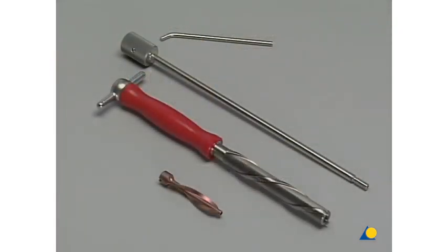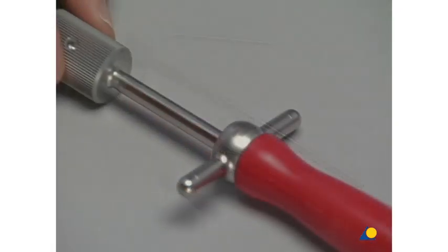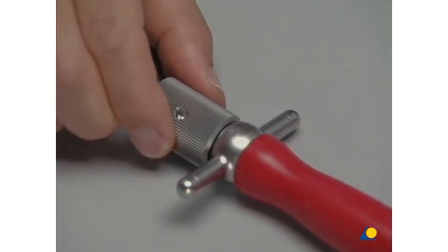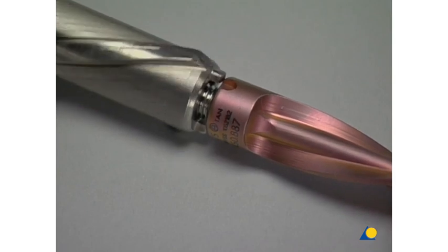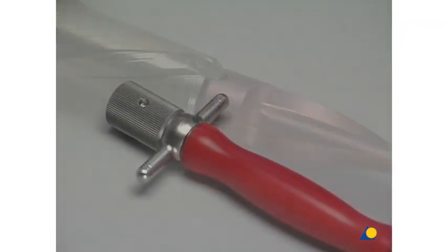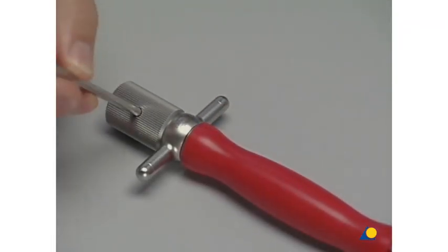The spiral blade is mounted onto the spiral inserter by first sliding the connecting screw into the inserter, then placing the spiral blade over the teeth of the spiral inserter and tightening the connecting screw using the pin wrench.